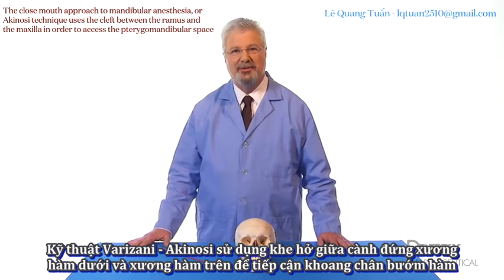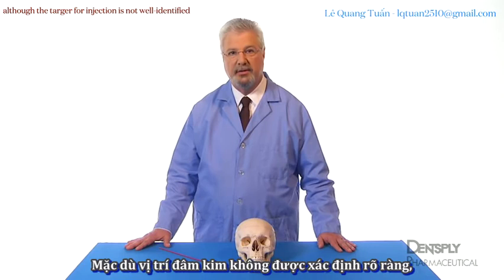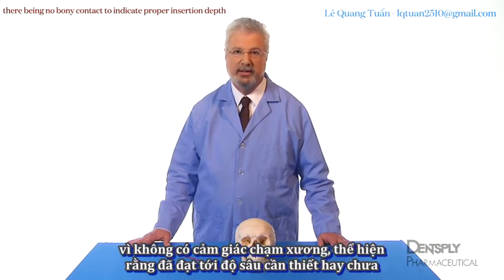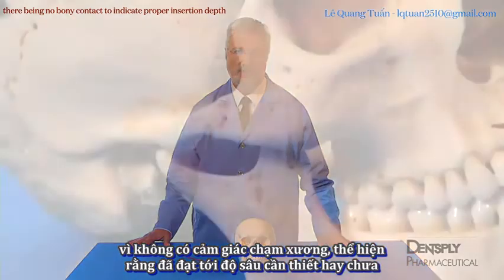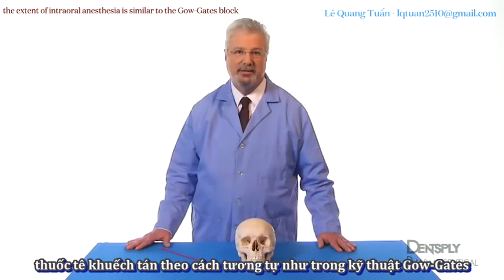The closed mouth approach to mandibular anesthesia, or Akinosi technique, uses the cleft between the ramus and the maxilla in order to access the pterygomandibular space. Although the target for injection is not well identified, there being no bony contact to indicate proper insertion depth, the needle ends up in the pterygomandibular space somewhat superior and medial to the standard inferior alveolar nerve block.